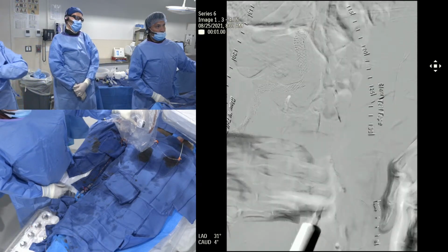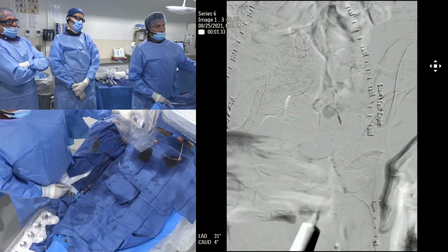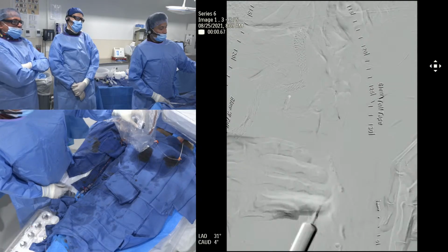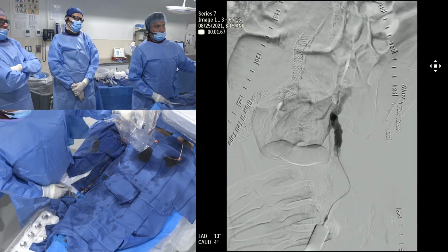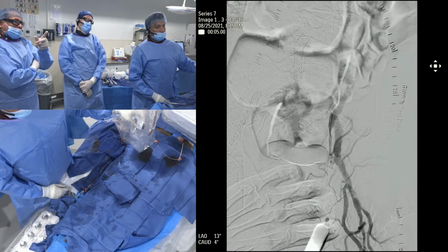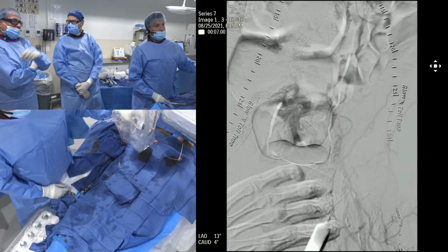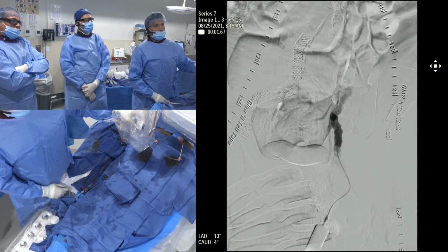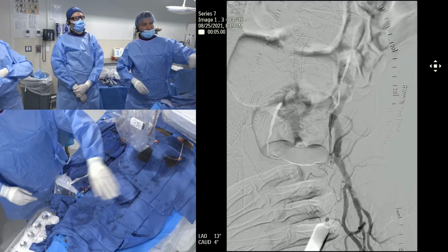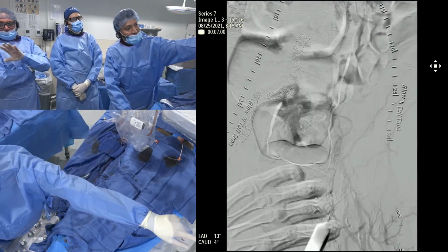So what you'd like to do is try to land this as far down the aneurysmal segment as possible, which will then allow you, hopefully, to cover that just into the ostium of the internal iliac. See, there's a lesion there too? See that? So that's why I think a 7079 is the right size. No, we definitely have to go across the aneurysmal portion. There's no doubt, but the question is, can you reach up to there? I think so, we're going to reach probably at that bend, right?